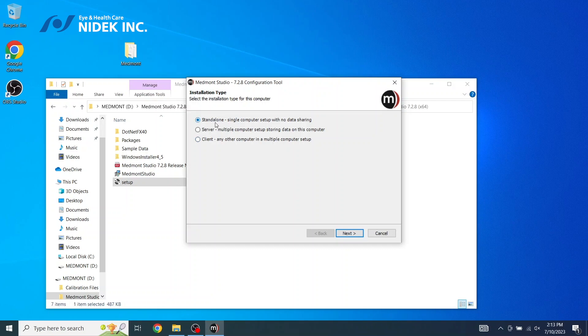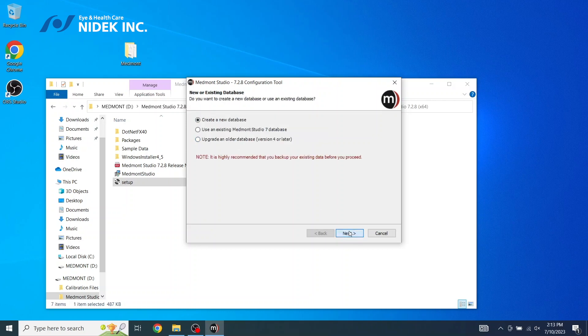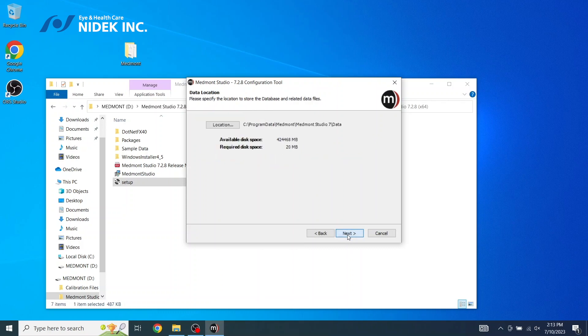This is going to be a standalone, single computer setup with no data sharing. If you have multiple licenses, you would select Server. Select Next. We're going to create a new database. Select Next.